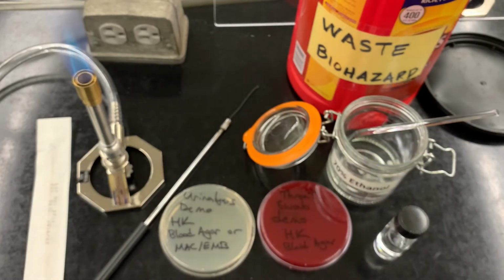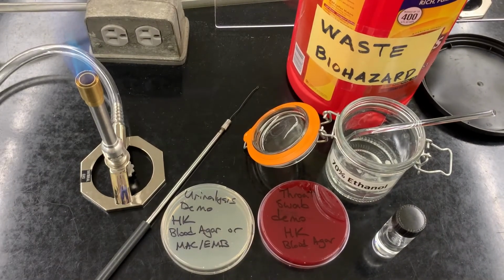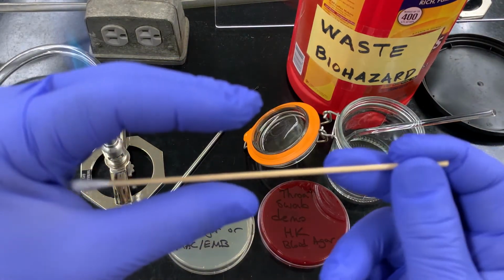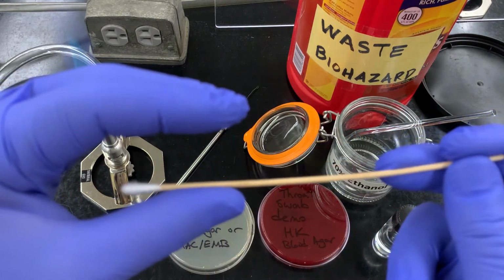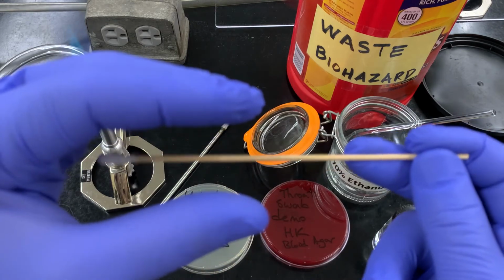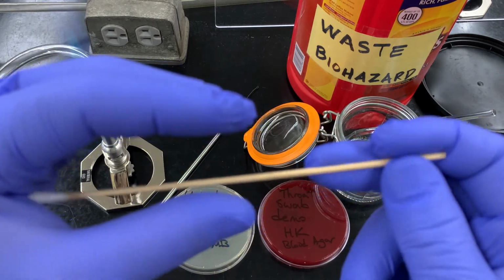All right, so let's show you how to do a throat swab. So in your book, there's a diagram as to how to grab it, right? But imagine this is the mouth. You just take your swab and then all the way to the back. You want to make sure it comes from the throat, right? Don't touch the tongue. Don't touch the roof of the mouth. Don't touch the sides of the mouth. Don't touch the little dangly thing. All the way to the back. Get yourself your nice little sample.